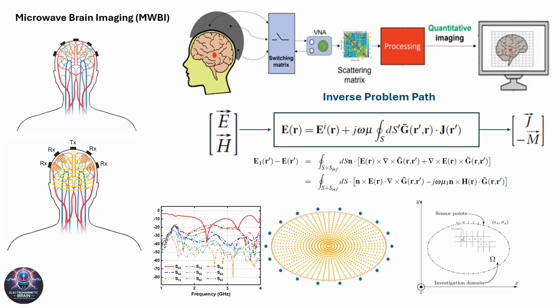The second method, reflection analysis, shown in the middle top illustration, uses active transmission. Antennas transmit and reflections caused by tissue boundaries are analyzed. The time of flight, TOF, equation, TOF equals 2d/c, calculates the distance to these reflective surfaces. Multi-antenna setups, as depicted in the diagram of sensor points on the bottom right, increase sensitivity and resolution, making it effective for detecting hemorrhages, strokes, and monitoring cerebral circulation.